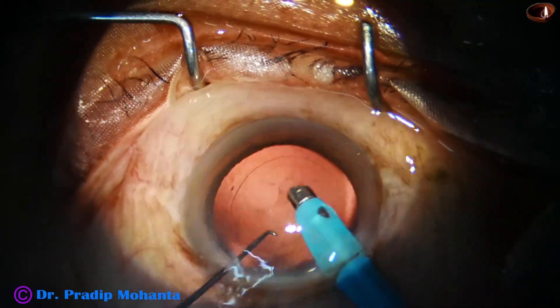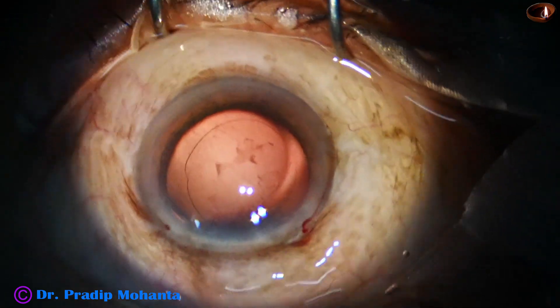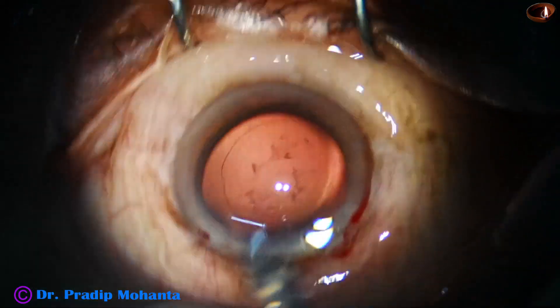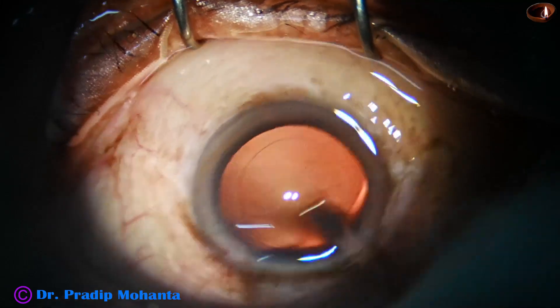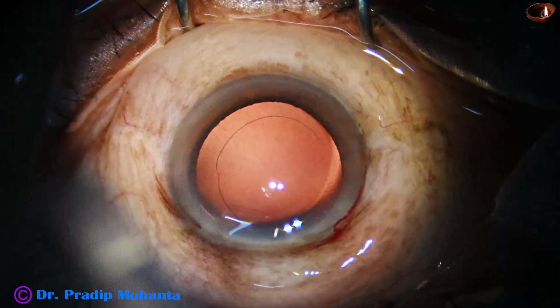Please be careful. Don't try this — if you try this, it is at your own risk. And now there are some cells sticking to the posterior capsule. You just use the irrigating probe to displace the cells from the posterior capsule.